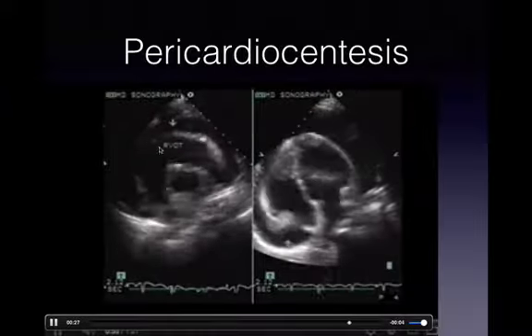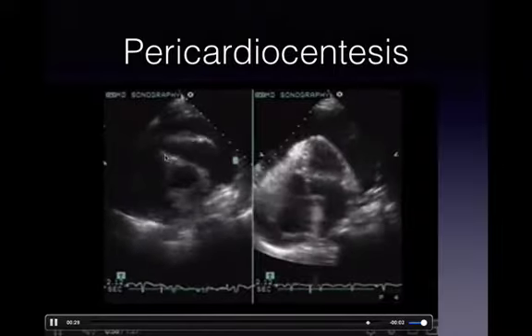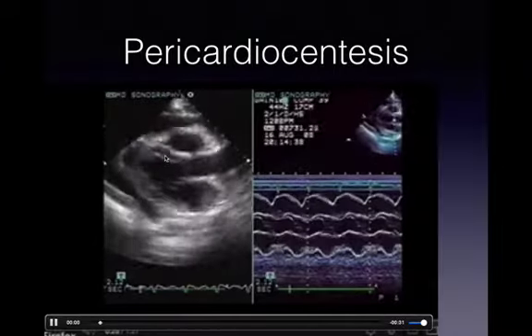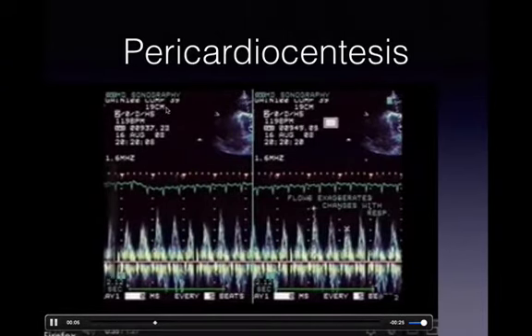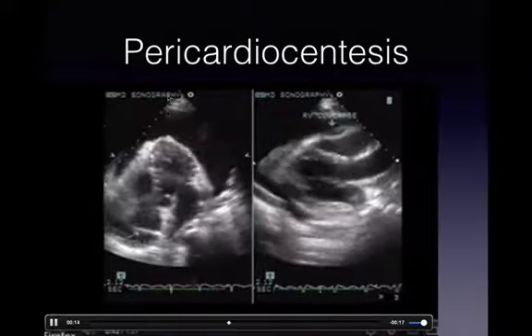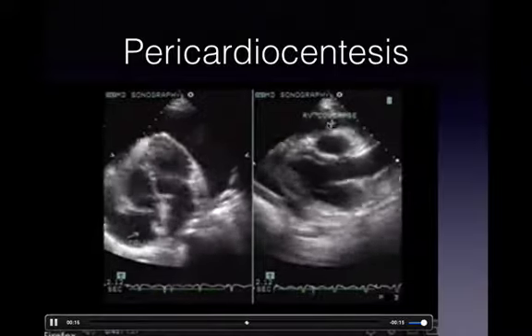This is that membranous septum of the right ventricle, and they'll put their needle just underneath the probe. This again is the electrical alternans. And they'll put their needle right in here to come in and right in here.